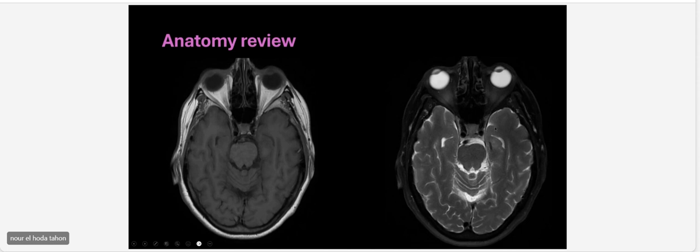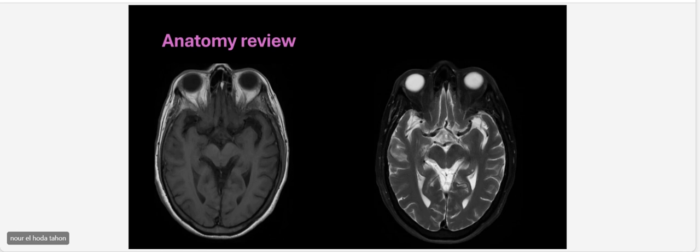And here is the area of the medial temporal lobe, and we start to have the hippocampus and the parahippocampal gyrus here. And again, this is the orbit you can see. If you don't know whether this is T1 or T2, always look at the orbit or look at the CSF fluid. It's bright, it's T2. And you can see part of the lens here. Okay, and as we get more up, we start to have here the sylvian fissure, and we have important vessels here. And the sylvian fissure of the other side, we start to have the inferior frontal and orbital gyrus here.